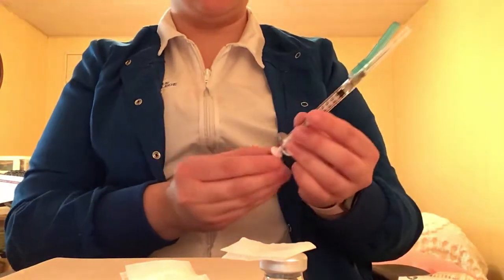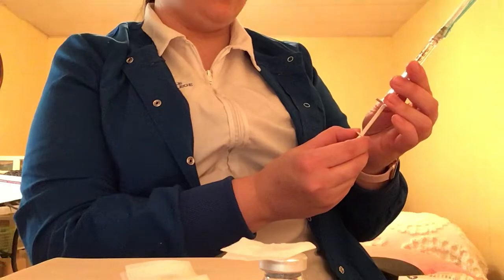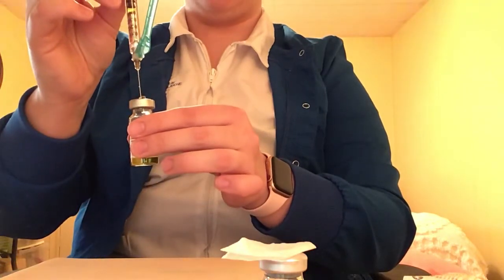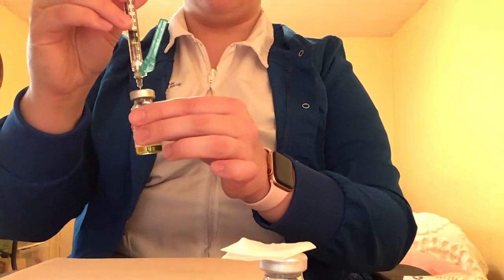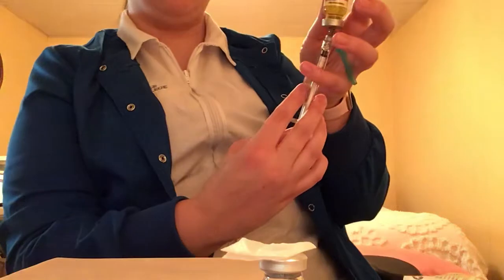So I'm going to start with my intramuscular needle and my injection. So I'm going to go ahead and withdraw back to 0.5 mLs. And I'm going to then remove the alcohol pad from the influenza vaccine. I'm going to open my needle like a rainbow. I'm going to inject in the middle of the rubber stopper and inject air to air. Now I'm going to invert. And I'm going to withdraw 0.5 mLs.